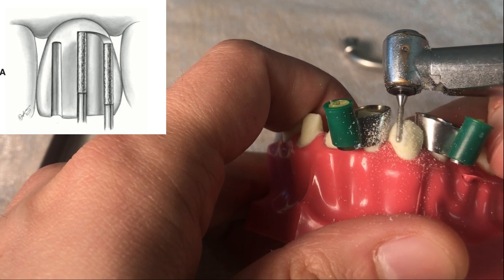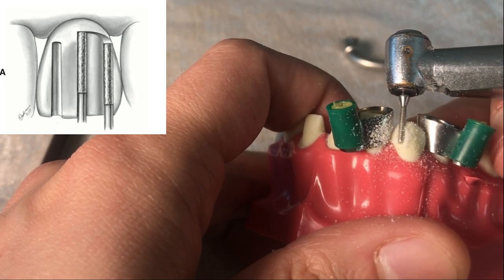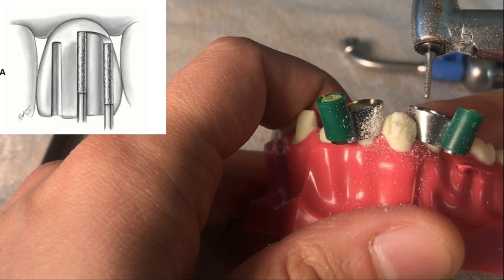I started the preparation from the buccal side. I formed 3 or 4 guiding grooves on the buccal.